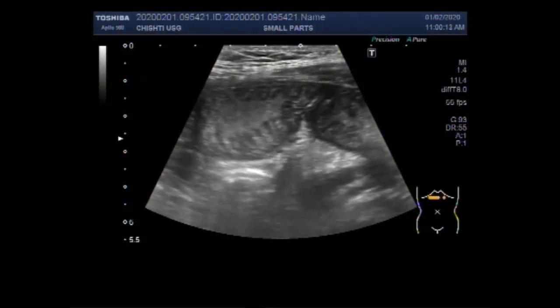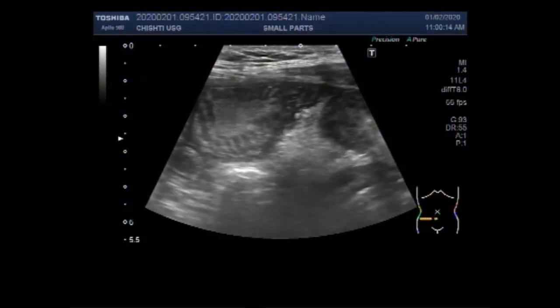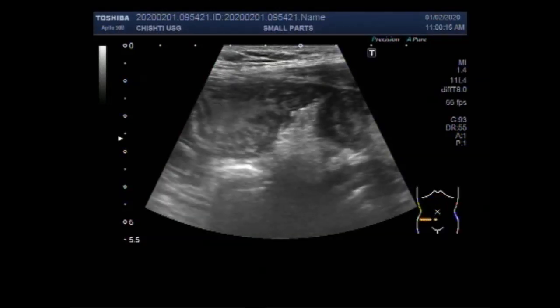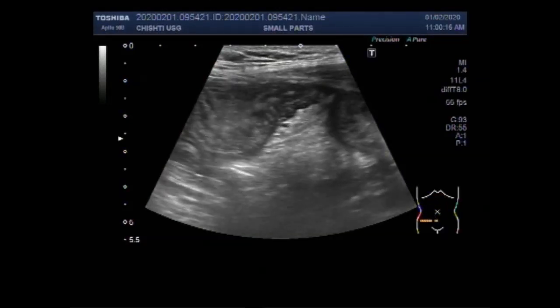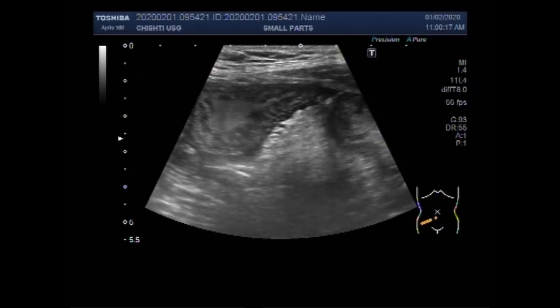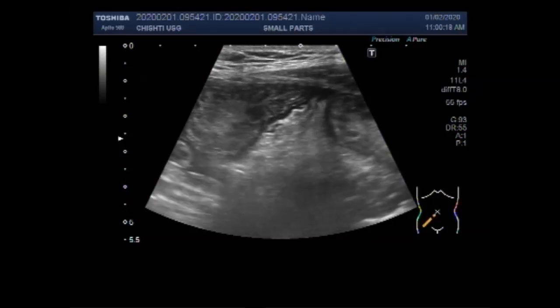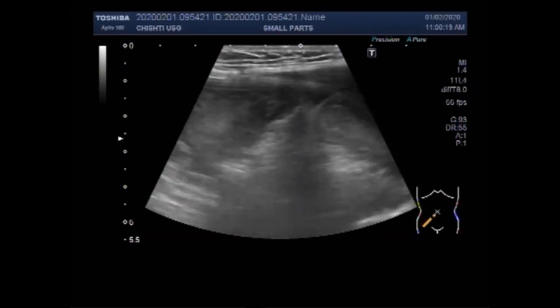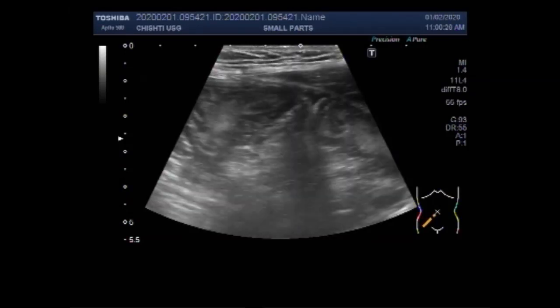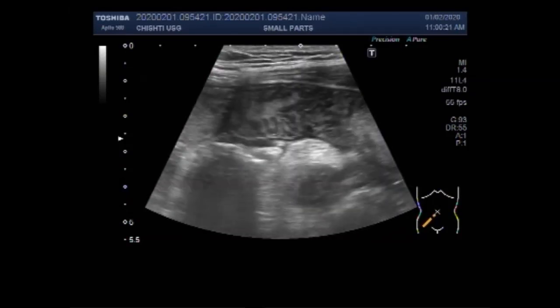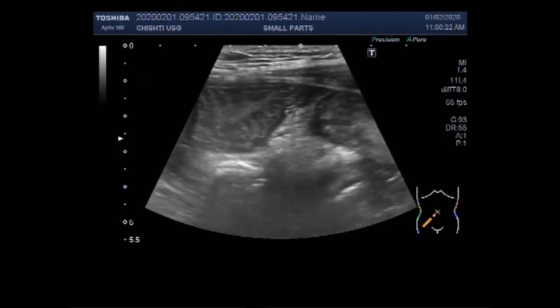Dear viewers, I hope you are all fine. This ultrasound video shows a case of acute appendicitis. You can see the gut loops seem to be slightly dilated.